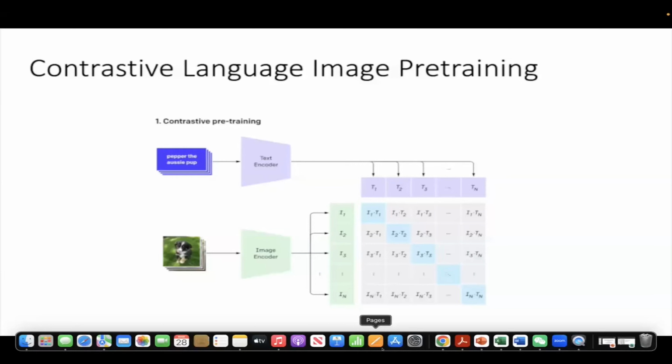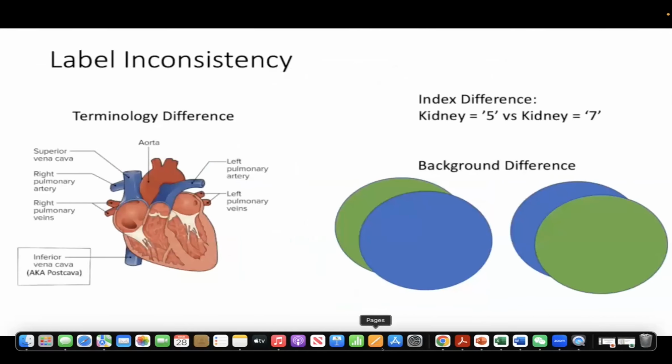So when we think about it in terms of image segmentation, we're adapting CLIP to look at the relationship between the imaging and the target, as well as the particular annotations such as tumor regions or left ventricle, and so on and so forth. This addresses the issues that we would see when attempting to collate these partially annotated data sets. Primarily, we would see label inconsistency as well as label orthogonality.